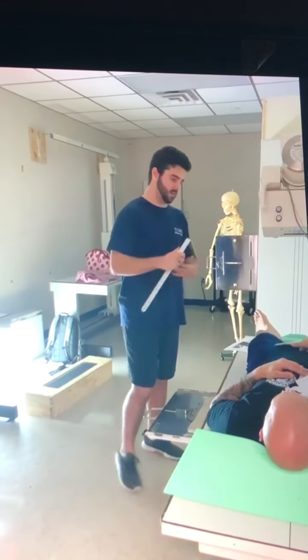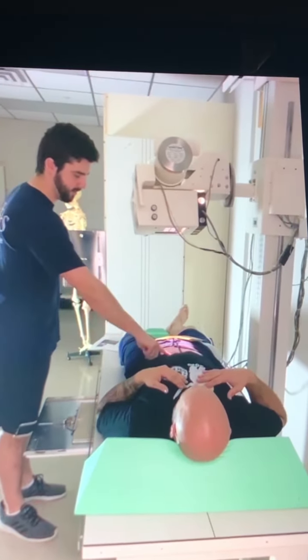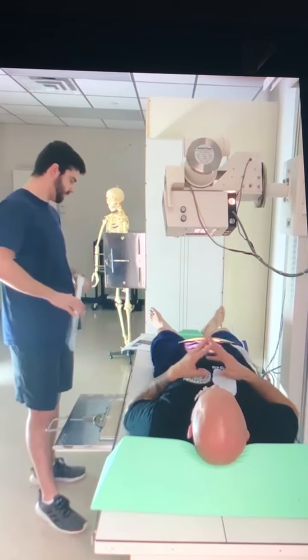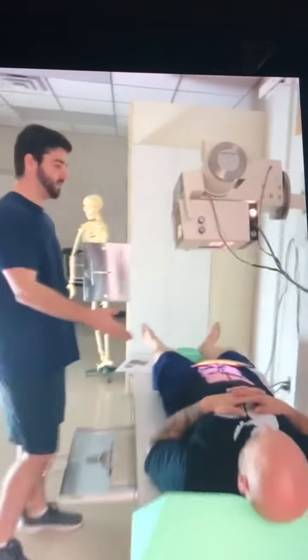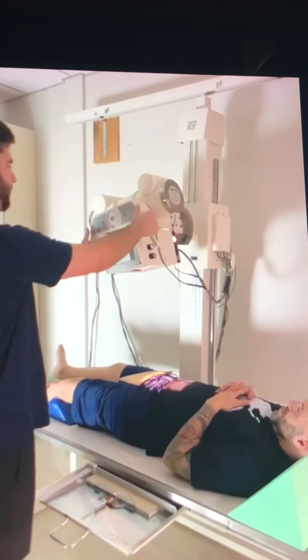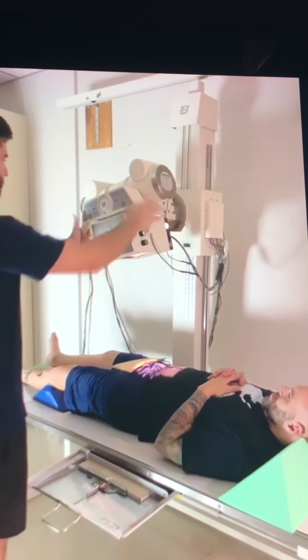So we'll do that. We'll be doing a marker. You just have it within the light. So on him, I probably have it higher up towards the lumbars because we're just looking at the sacrum. The focal film distance is 40 inches, but the AP sacrum has a tube tilt. So it's a 15-degree tube tilt. So I put it at 15 degrees. I'm going to bring it down 3 inches because every 5 degrees is 1 inch.